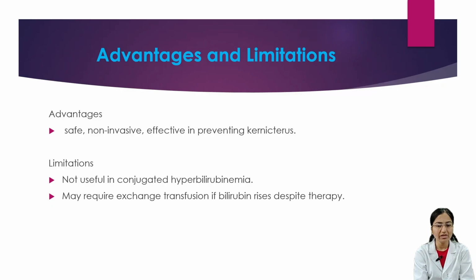Next we will see the advantages and limitations of phototherapy. The advantages are that it is safe, non-invasive, and effective in preventing kernicterus. The limitations are that it is not useful in conjugated hyperbilirubinemia, and may require exchange transfusion if bilirubin rises despite therapy. These are the advantages and limitations of phototherapy.